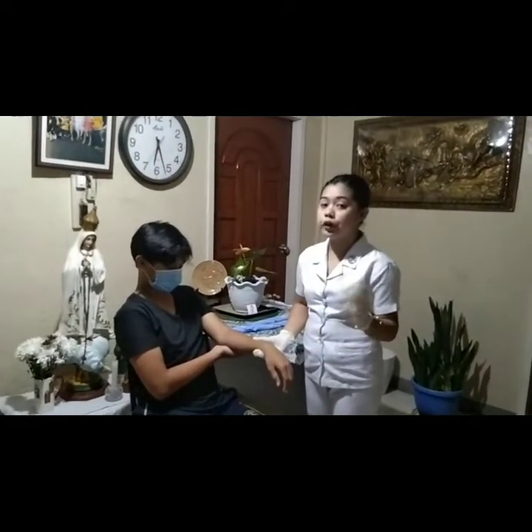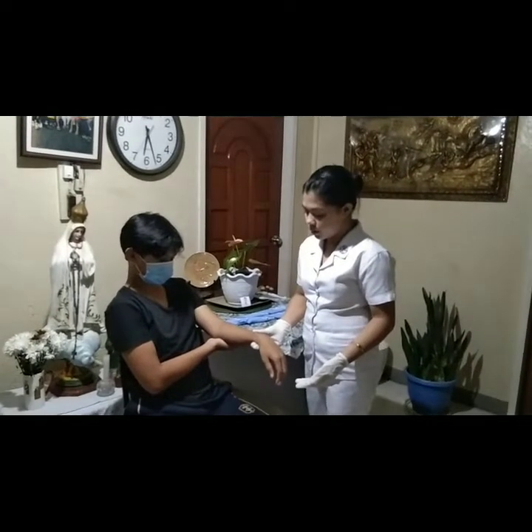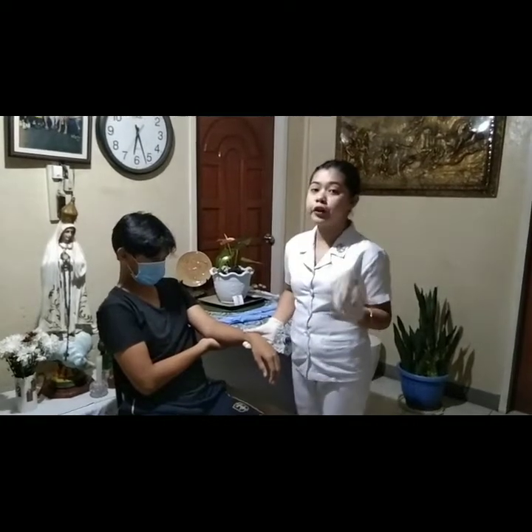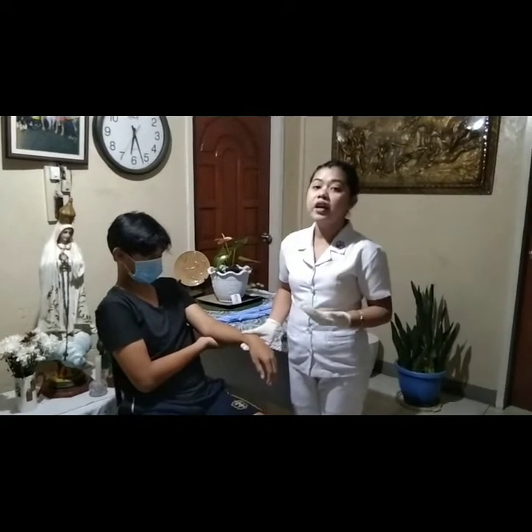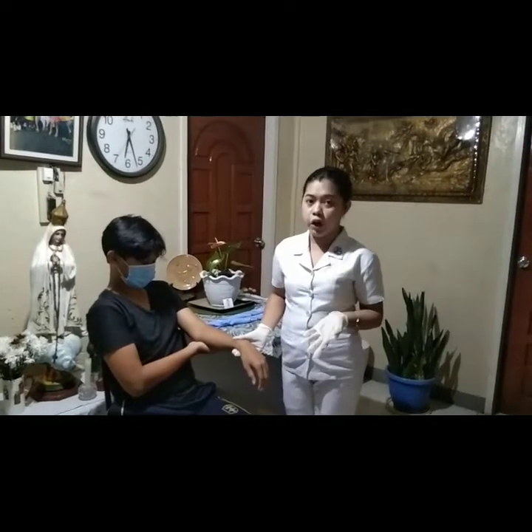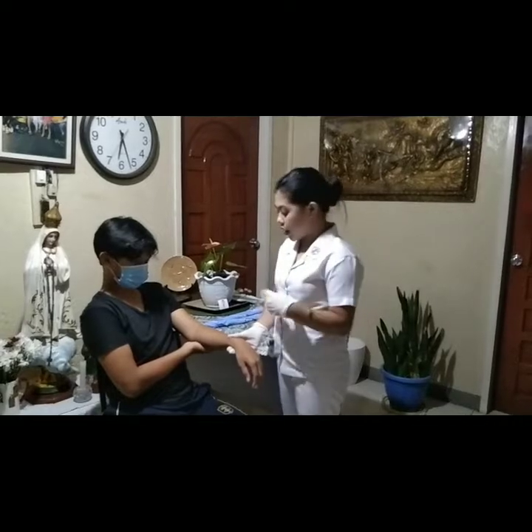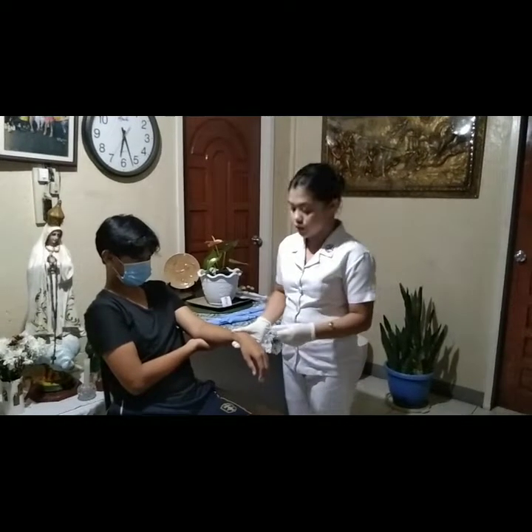While checking for the warmth, we can also check for the pulse. So, the pulse is good. Then, we should check for the color. Always remember that if the color is pale, then there's an obstruction in circulation or there's bleeding. But since the patient's color is pinkish, then it looks good.